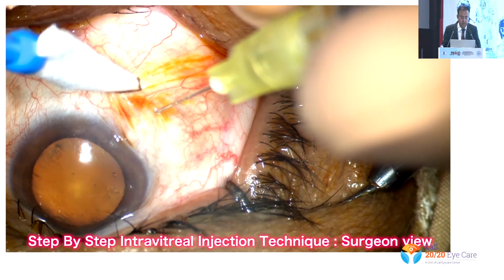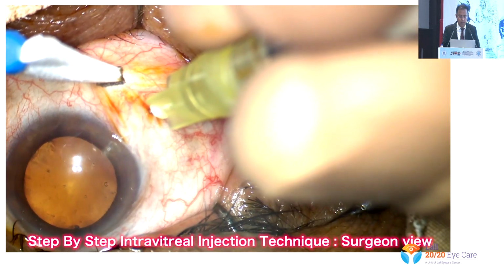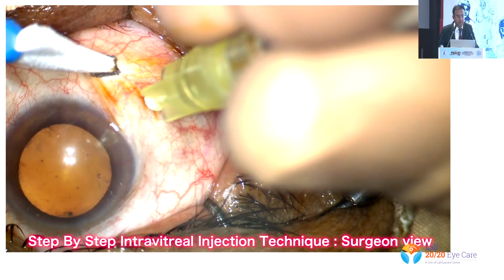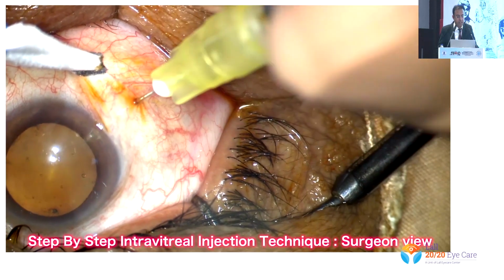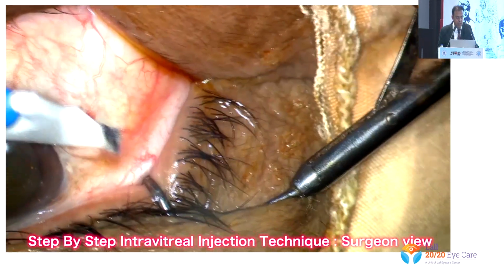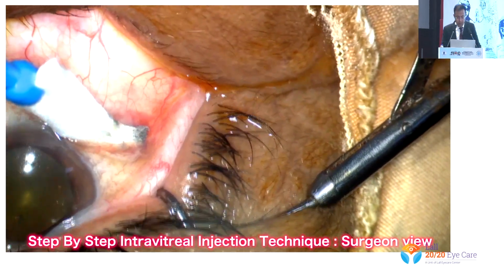You can see here again. Sometimes there can be a subconjunctival hemorrhage. You need not worry about it. You should tell the patient there and then there can be some redness in the eye, which the patient should not worry about. You can see here there's a thing.